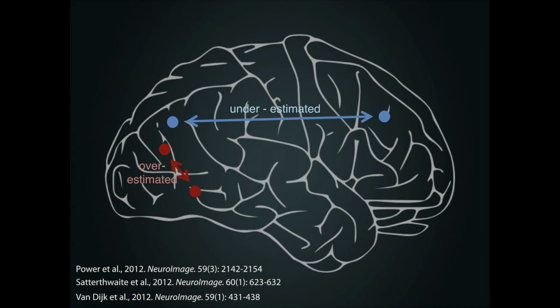And in high motion datasets, they resulted in a bias of functional connectivity, whereby nearby regions of the brain had artificially enhanced connectivity, but distant brain regions had artificially reduced connectivity. And in this case, connectivity refers to any measure of association between the time series, such as the Pearson correlation. Now, it's fairly easy to see how such a bias might arise. If we consider a simple example whereby a subject has performed a pitch movement in the scanner, the front of the brain would move more than the pivot point. This means that movement artifacts are likely to be more similar in neighbouring voxels at the front of the brain.